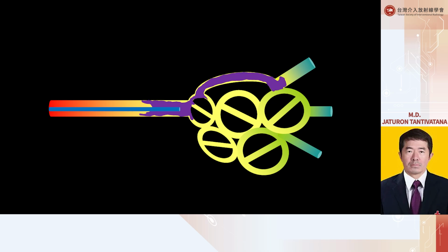So this becomes partially solidified. And then when we begin injection again, this one acts like a cast and pushes the Onyx into the smaller channels. And then again, we can predict that the Onyx will propagate into the larger channel inside first, by the same principles.